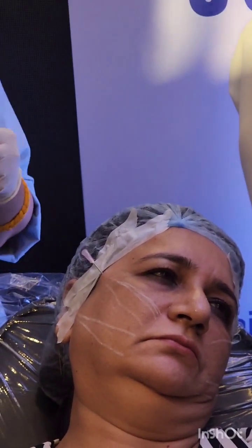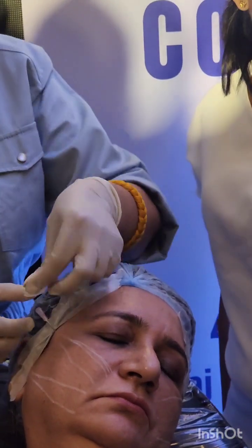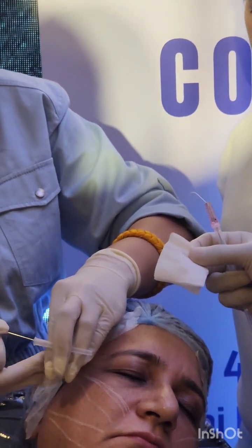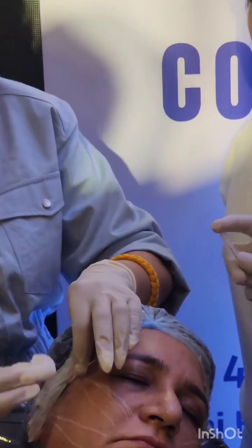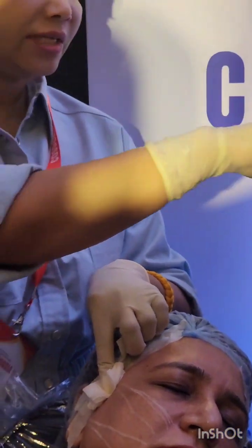The rejuvenation with mono thread. That's for rejuvenation. That is like cross hatching. So what will be for acne scars? Even if it's bleeding, doesn't matter. Even if it's bleeding profusely, doesn't matter.